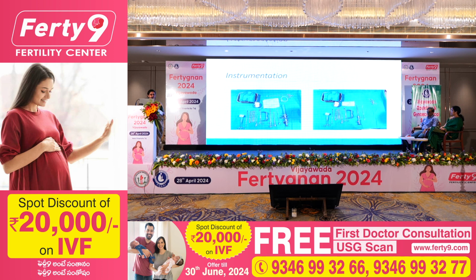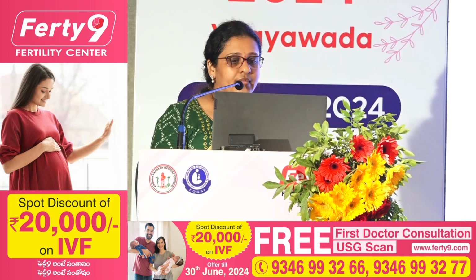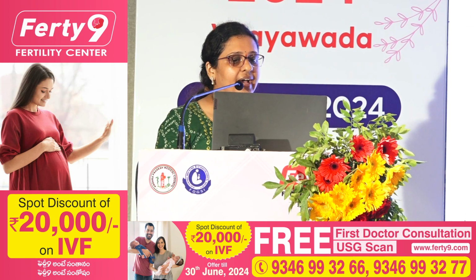This is the basic instrumentation which is to be there on your trolley. These are the uterine sounds, speculums, the sponge holders, the basic hysteroscope with its outer sheath, and this is the resectoscope, and when you are using a resectoscope you should have a TURP set available with you. These are the different diagnostic hysteroscopes which have been shown. A flexible fiber optic hysteroscope, a miniature hysteroscope has come up with a diameter of 2 mm which can be used in your daily office procedures. And these are the different instruments inserted through the office hysteroscope: the forceps, scissors, unipolar and bipolar electrodes. And this is the telescope.